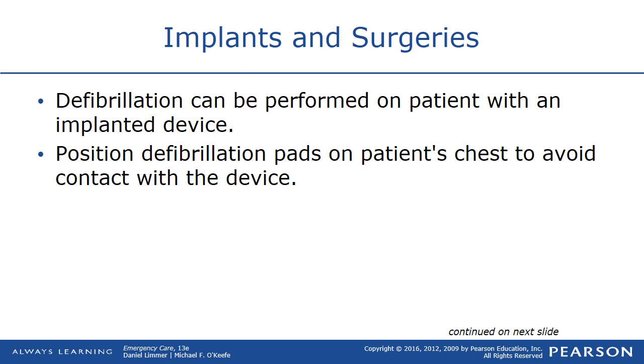Just don't put the AED pad over the device. Not a problem if it's on the left side, but once in a while, the patient has it on the right side, and you might have to move the pad so it's not covering it. So position the defibrillation pad on the patient's chest to avoid contact with the device.